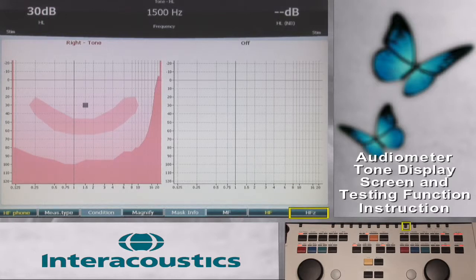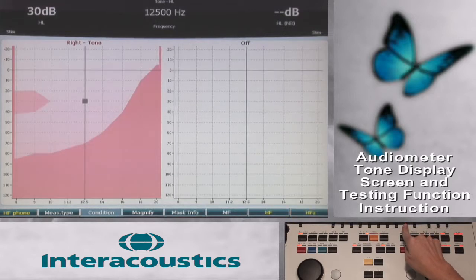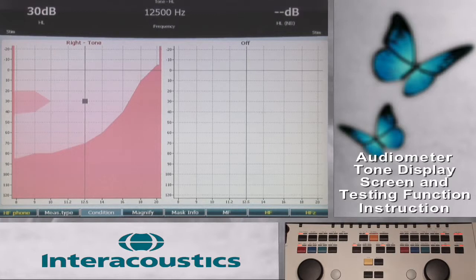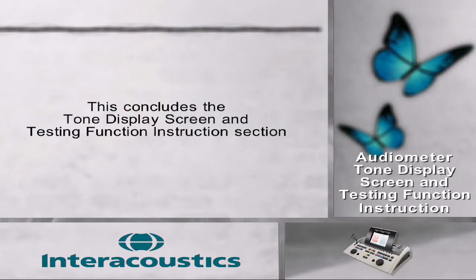The HFZ, or high frequency zoom, function key displays the high frequencies 8000 through 20,000 hertz only on the display screen. This allows for increased visibility of the specific frequency and stored threshold. This key will only become active when the audiometer is licensed for high frequency testing and the HF phone function key is selected first.